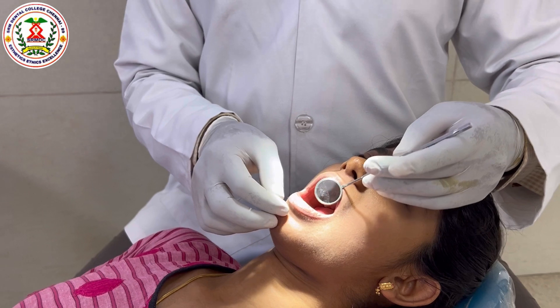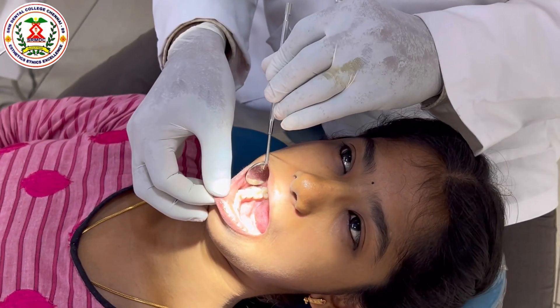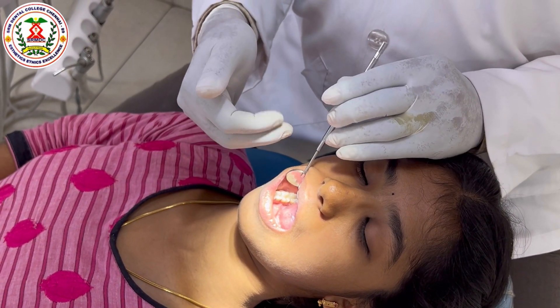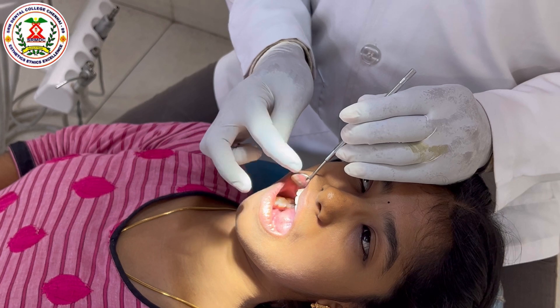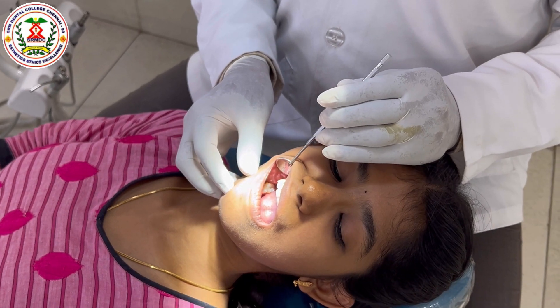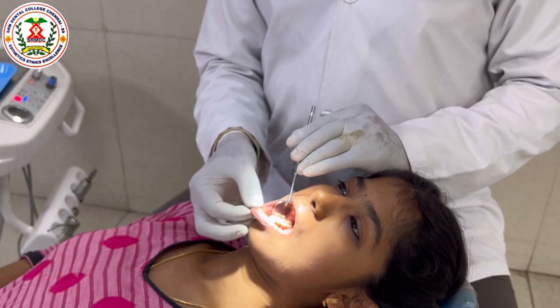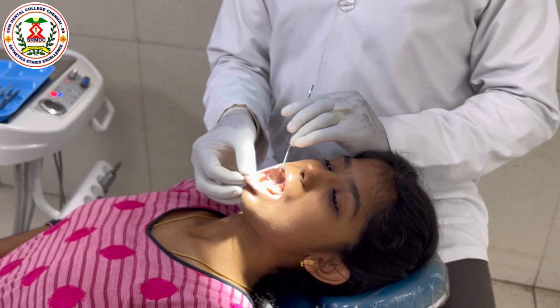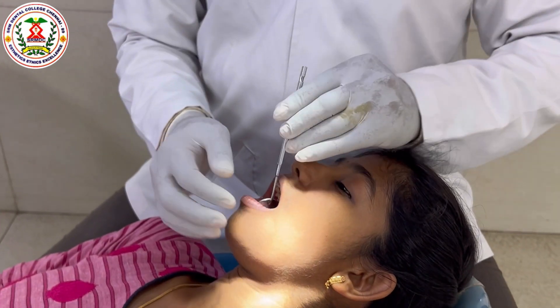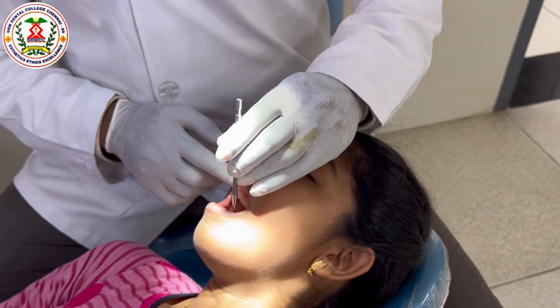For the mandible in V2, ask the patient to look down so you can directly visualize the mandibular teeth. Next is V3, which depends on the quadrant — whether you want to work on the right or left side, the buccal or the lingual. For the maxillary buccal arch or the cheek side, ask the patient to move their head to the left side so you can visualize directly without bending down. You can work on both maxilla and mandible by asking the patient to look to the left. To work on the lingual side, ask the patient to move toward you. In V3 position, you can see the maxilla and mandible in direct vision without any awkward positioning.